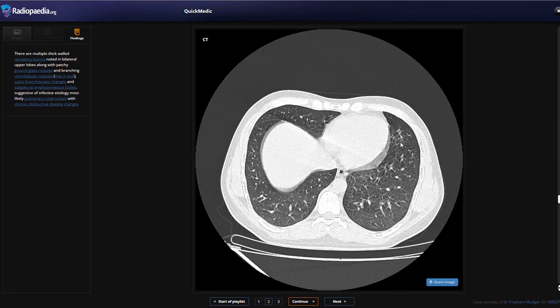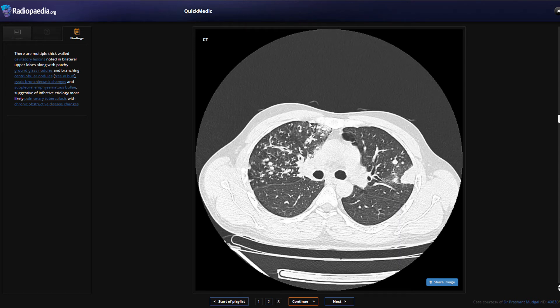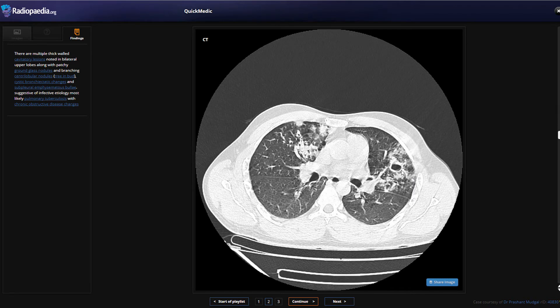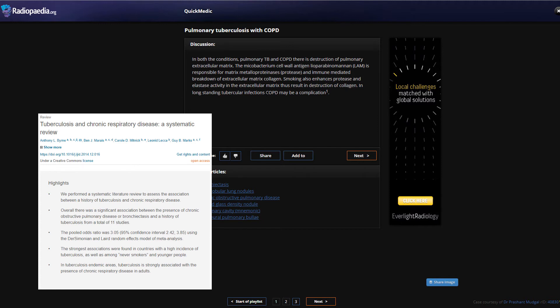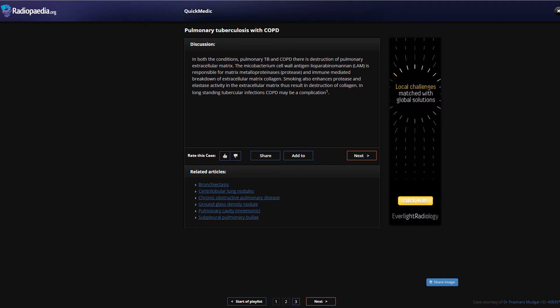In both pulmonary TB and COPD there is destruction of pulmonary extracellular matrix. The mycobacterium cell wall antigen LAM is responsible for matrix metalloproteinases - a protease and immune-mediated breakdown of extracellular matrix collagen. Smoking also enhances protease and elastase activity in the extracellular matrix, resulting in destruction of collagen. In long-standing tubercular infection, COPD may be a complication - it may not be due to smoking but due to the long-standing infective tubercular infection. This patient is only 30 years old with these very rough-looking lungs.